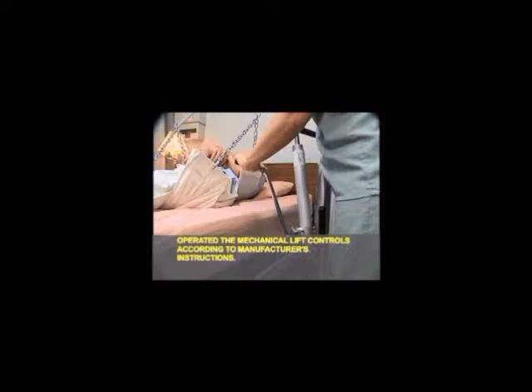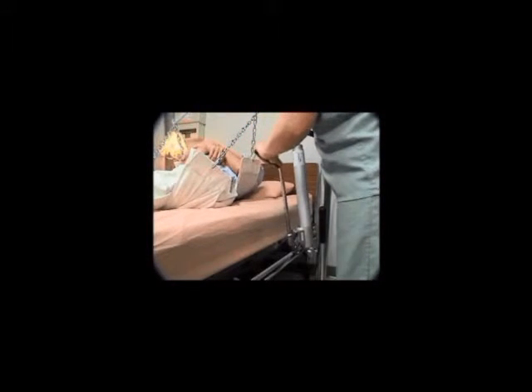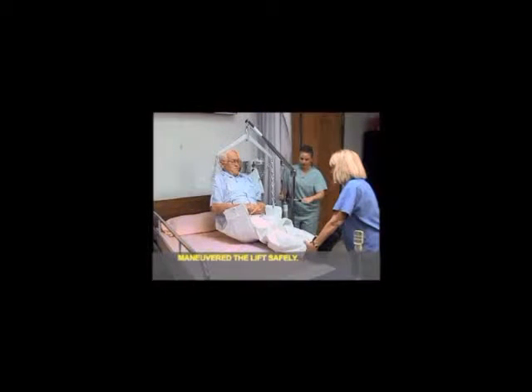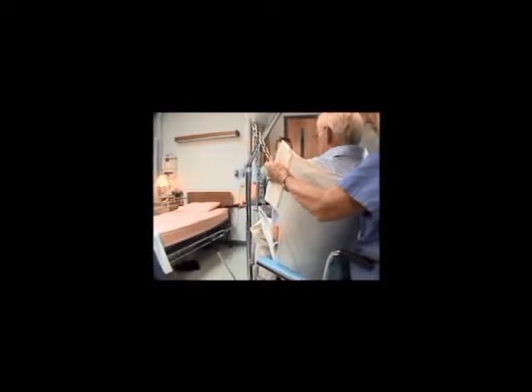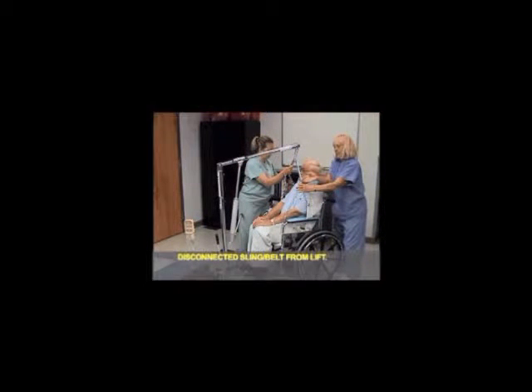Operated the mechanical lift controls according to manufacturer's instructions. Maneuvered the lift safely. Lowered residents safely. Now I'm going to slowly let you down. Disconnected sling belt from lift. Remove sling belt if applicable.